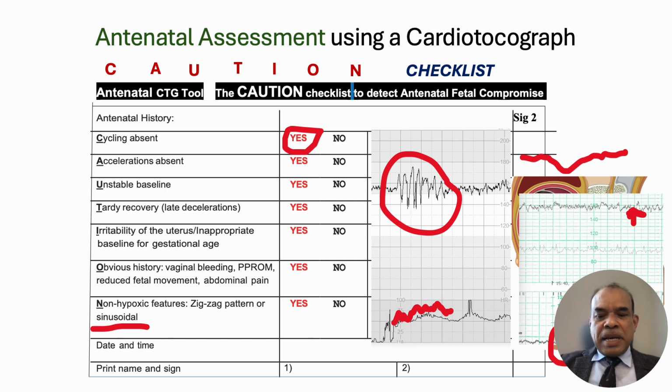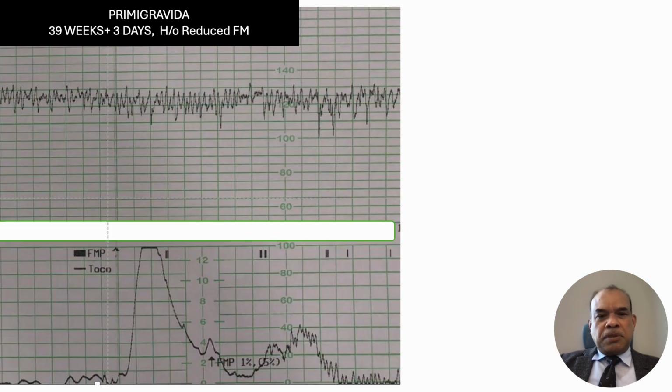They maintain the baseline variability but would not show presence of cycling. The deep sleep cycle would be lost. And this is why standard guidelines and computerized CTGs often miss these fetuses, causing poor neonatal outcomes.